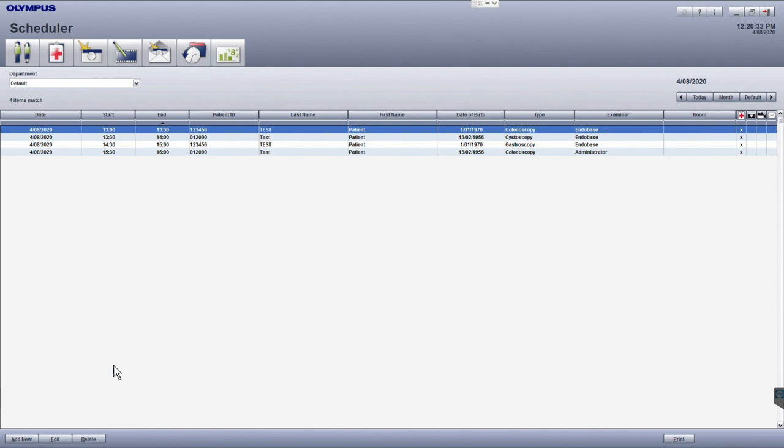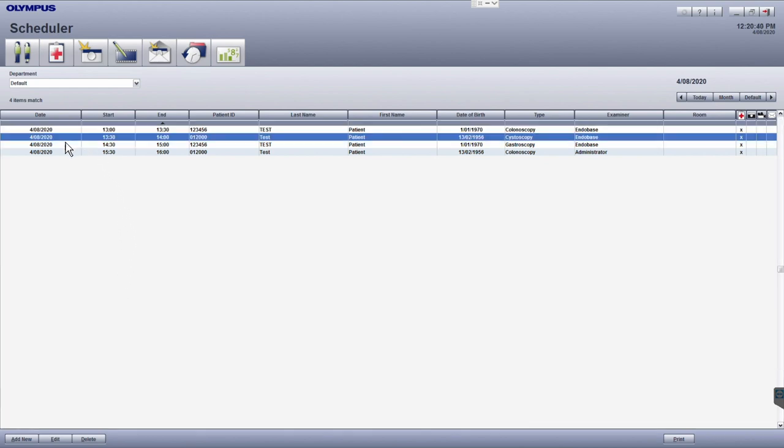Lastly but most importantly, to select the right examination you're going to be working on, you will need to click on that row so that it becomes highlighted. This will select the correct examination for you to perform the next steps in documentation.